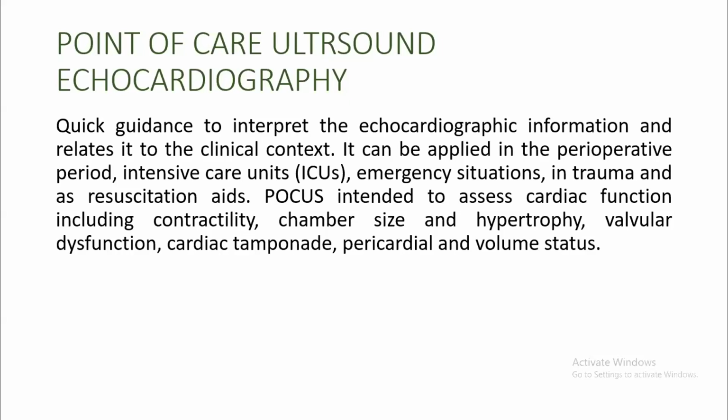It is not conventional echocardiography. We are not measuring the valve diameter. We are not measuring the contractility by numbers. We are just estimating. It is a rapid assessment of cardiac function in an emergency situation, and it is very helpful. It is very useful, and it is widely used now in intensive care, in anesthesia, and in the emergency department, especially when receiving a trauma patient or shock patients, whether septic or hypovolemic. It is a very useful aid.